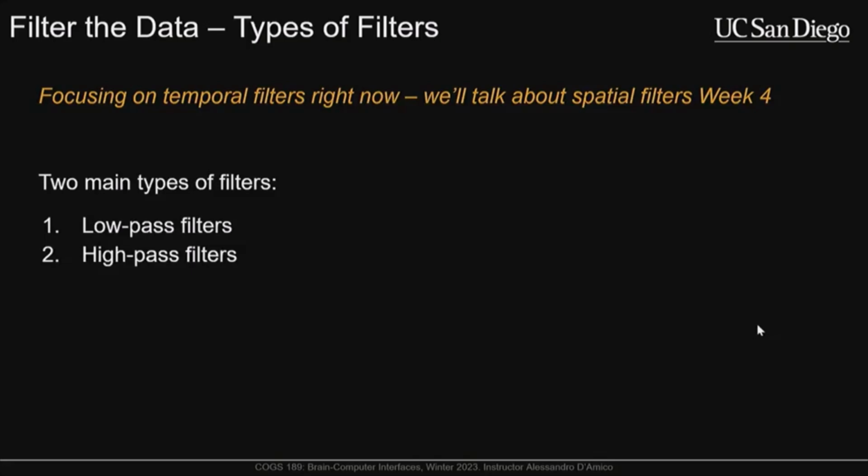Okay, so once you've baseline corrected the data, you'll typically apply some sort of filters to it. Again, you can filter before, but you can filter after. And there are two broad categories of filters, which are going to be low-pass filters and high-pass filters. I know when I was first learning about filters, when I was doing audio processing, I would always get confused between the two, but just read it literally.